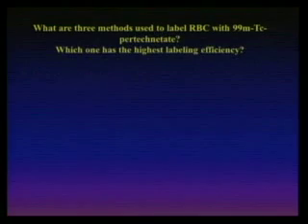So transfusion, we said don't do that. And then 3 methods. We have a little bit of time, so I'll just go over this. But remember, this will show up on your test. We use the technetium-labeled RBC tracer for this GI bleeding study. We have 3 methods to label RBC.